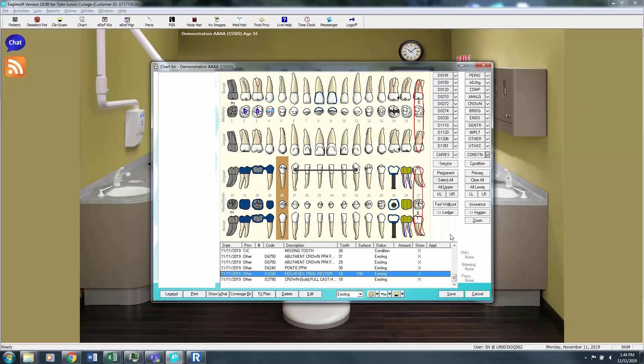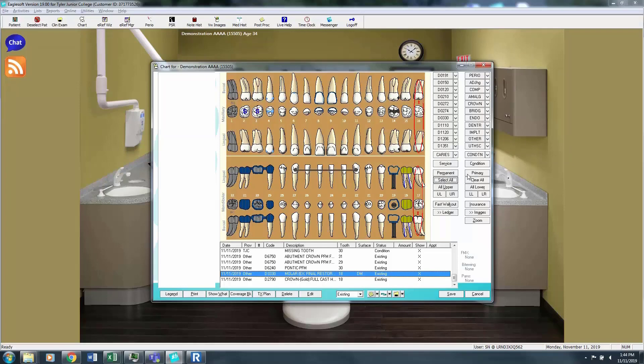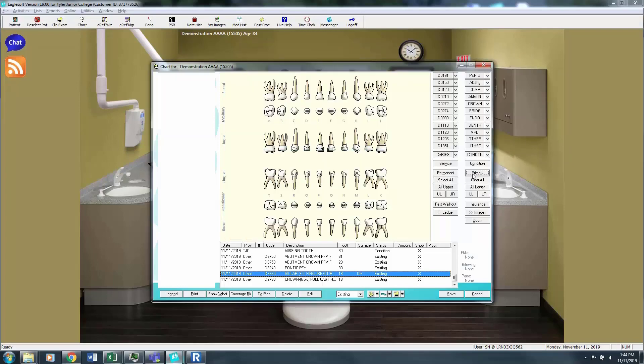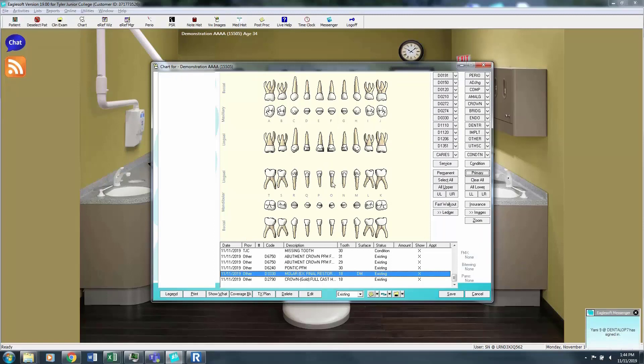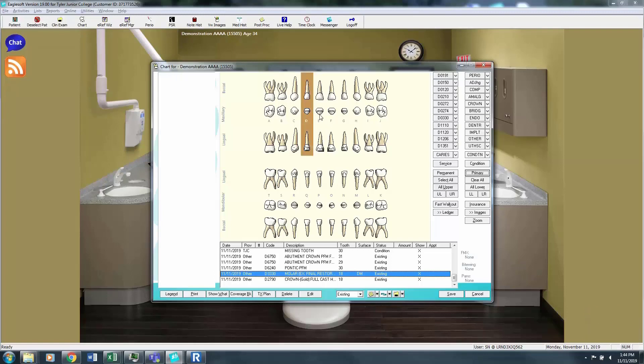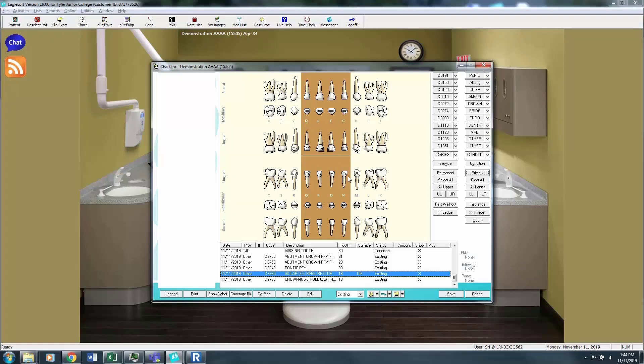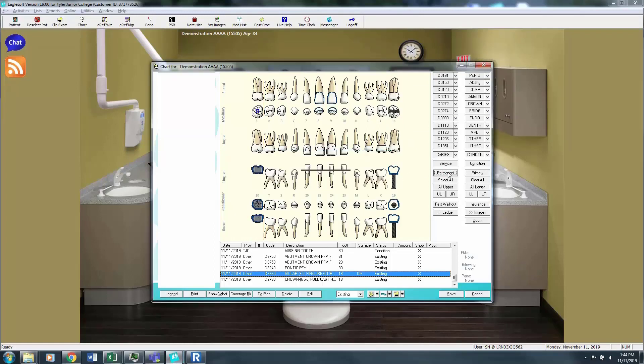If you are seeing a child or mixed dentition patient, in order to change them all to primary, if it's a younger child that has more primary teeth than permanent teeth, you can click select all and change them all to primary. Then you would select just the ones that are currently permanent. So say this patient is about eight years old. So we're going to say this patient has permanent maxillary and mandibular incisors and that they have their six-year molars. So you're going to click where the six-year molars will be erupting and then click permanent. And that will change it to mixed dentition.